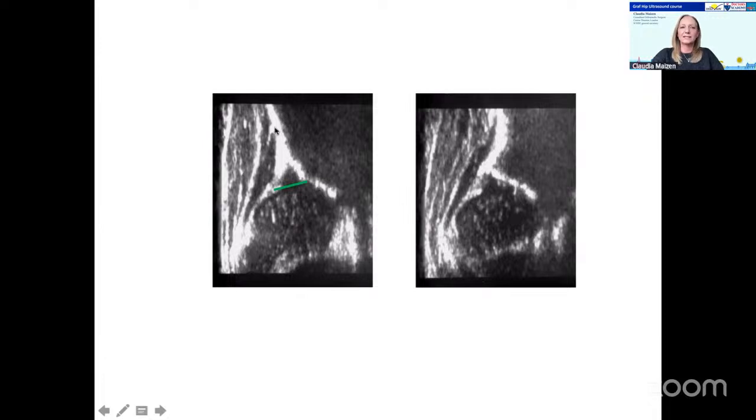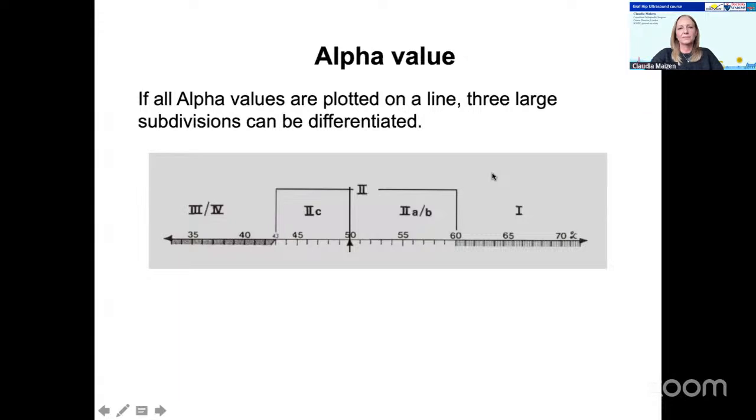So this is an anterior plane. So we have our lower limb here and we have our labrum here, but our plane is not straight. On the right side, again, we have a centered hip. The labrum is below the turning point, but in this case, we have a posterior cut. So again, we're not in a standard plane. We're not allowed to measure this picture.